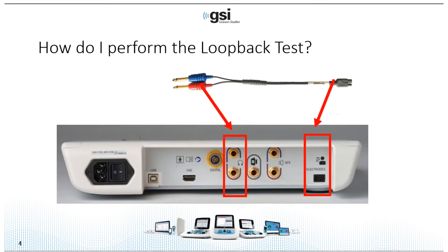To perform the test you need the loopback cable included with your system. You're going to unplug the insert earphones from the back of the Audera Pro and plug in the loopback test cable, blue to blue and red to red, making sure it's firmly inserted. Then unplug your patient cable and plug in the other end of the loopback test cable into that same port.